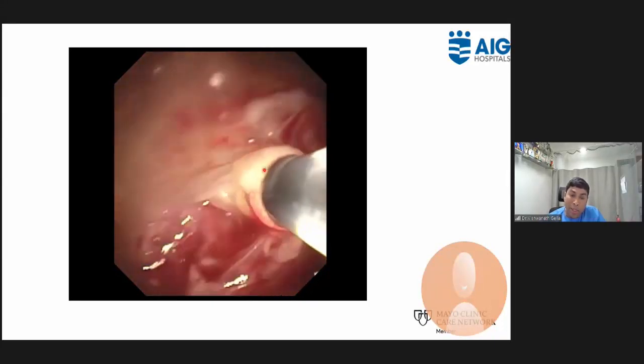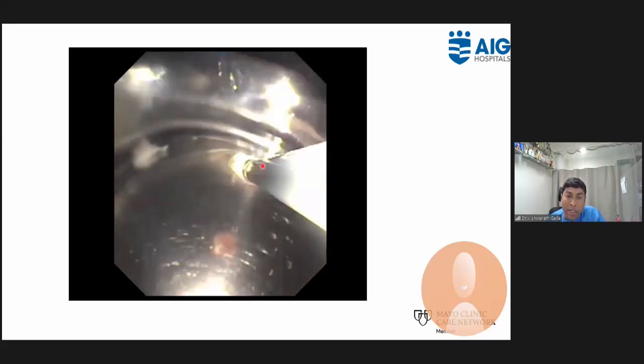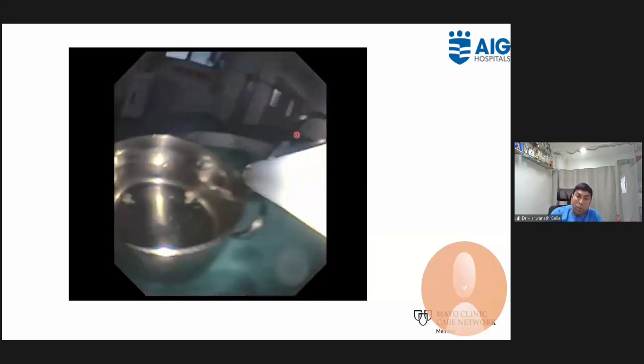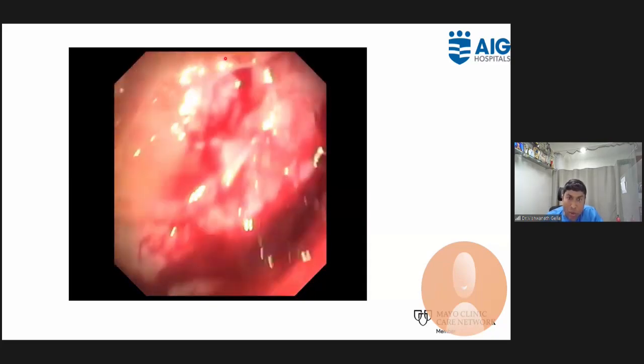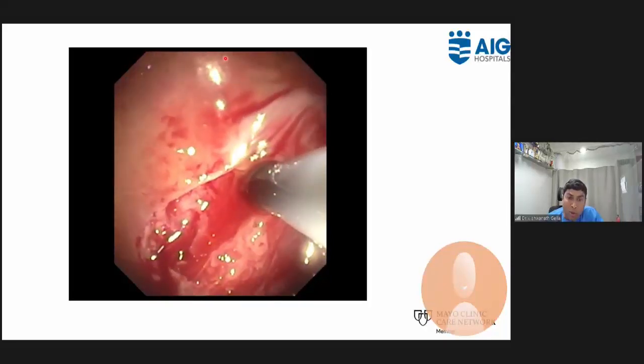So you are applying that on the pleura. In cryo lung biopsy, you ideally freeze for 4 to 5 seconds. Here you can use a longer freezing time. You can get up to 7 to 8 millimeters. And once you get a tissue, the cryoprobe and the semi-rigid thoracoscope are both pulled out together.